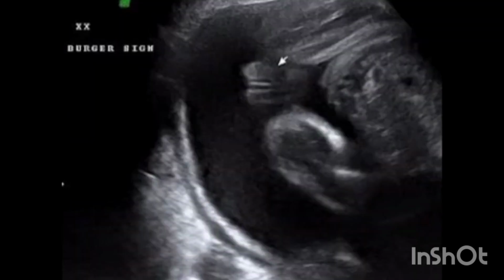This 20-week ultrasound is a bit more obvious if you're looking for the classic hamburger sign of 3 white lines. The 3 white lines, which are actually the labia with the clitoris in the middle, can resemble 2 buns and the meat of a hamburger. This image is more easily defined as you can see the baby's thighs, too.